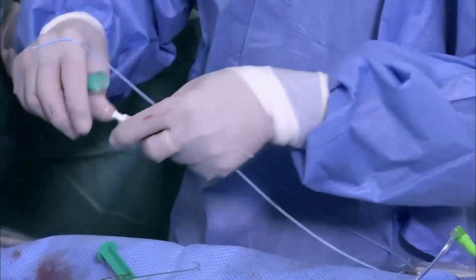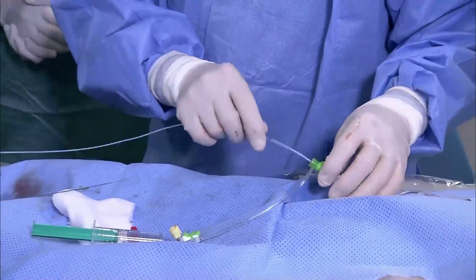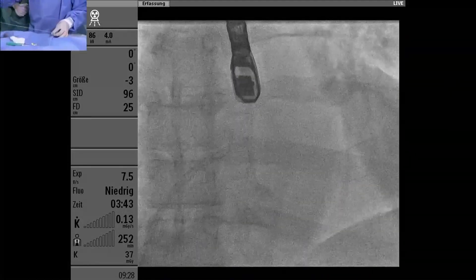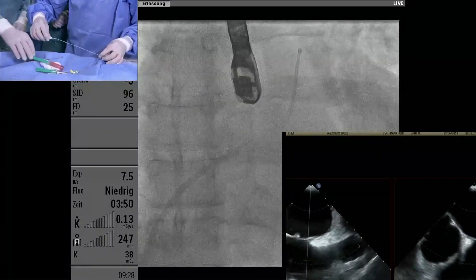I now prefer to go to the pulmonary vein, but we could also make just a loop in the left atrium of course. You have to insert a 12-French sheath, so a little bit of stability is good to have.